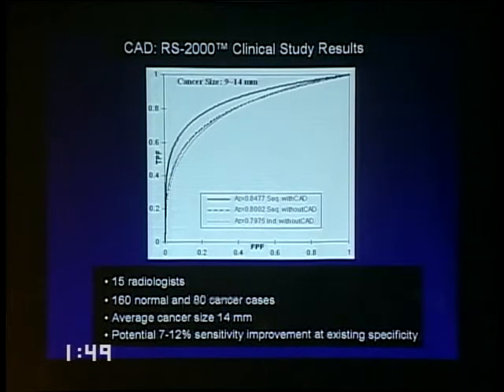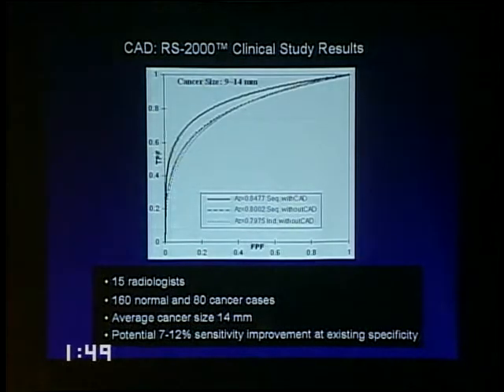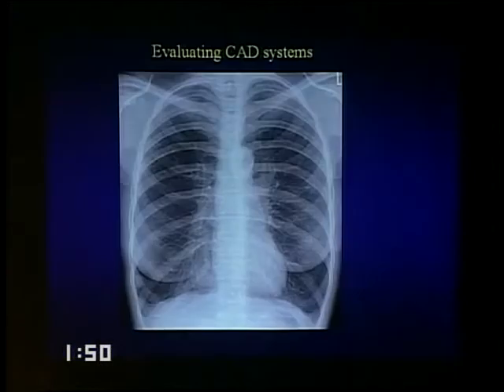And a commercial system is now available that was developed by a company called DES, now marketed by General Electric Medical Systems, that can detect nodules in digital chest radiographs, and this has shown a significant improvement in, again, observer testing situations. Now, since there are several of these systems probably going to be on the market, I'll just say a word about how you might want to evaluate a computer-aided diagnostic system. How do you compare them? How do you evaluate numbers like sensitivity and specificity? If one company says its sensitivity is better than another, what does that mean?